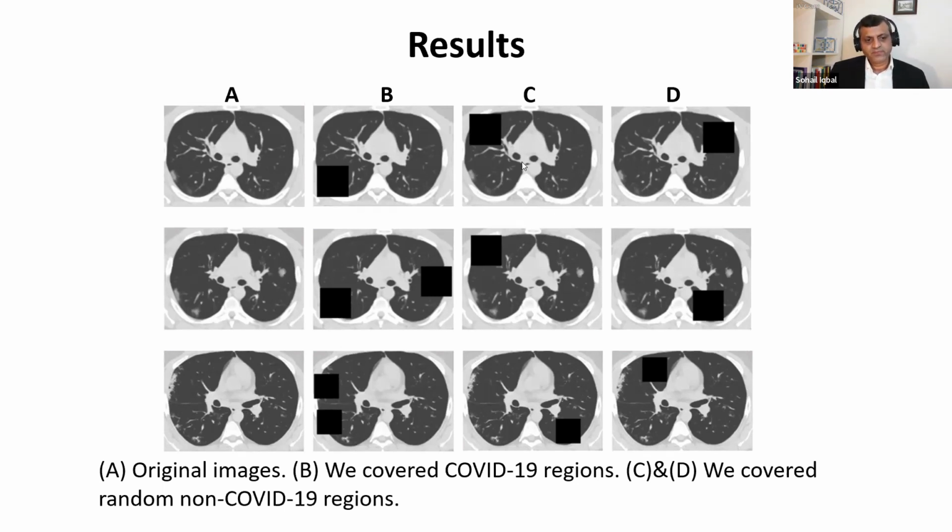And if you put this box on some other region apart from the COVID, then once again our model says that this is a COVID image. Similarly, there are some other random approaches as well. That's the interpretability of our result. And of course, apart from that, we can also tell why the model is detecting, due to which topological feature.